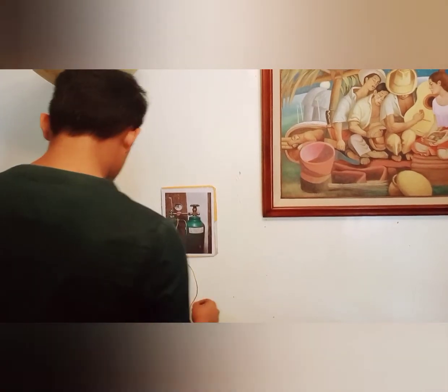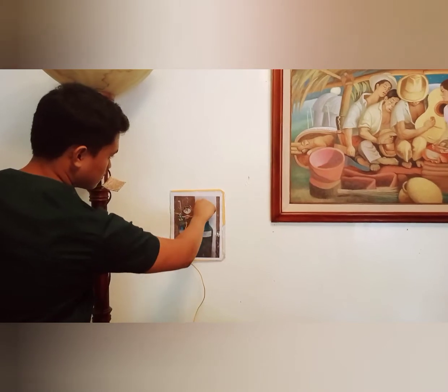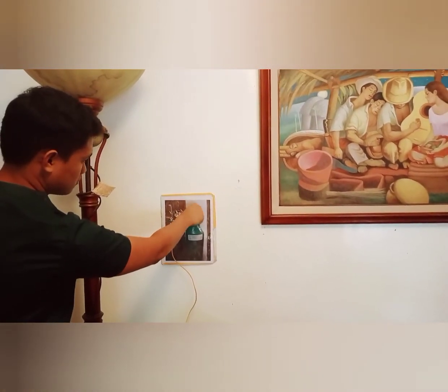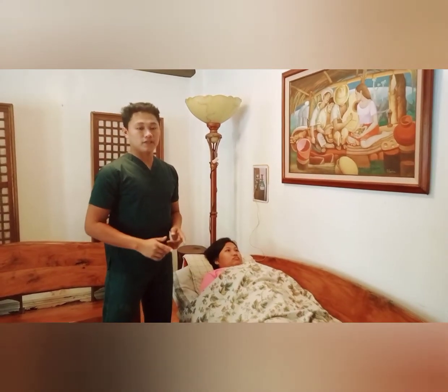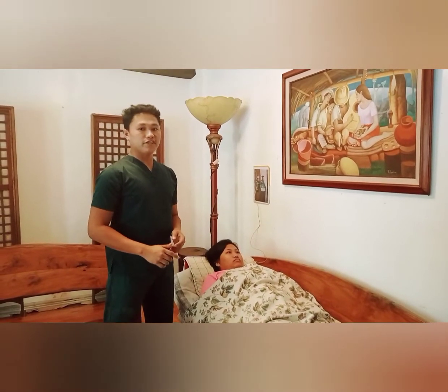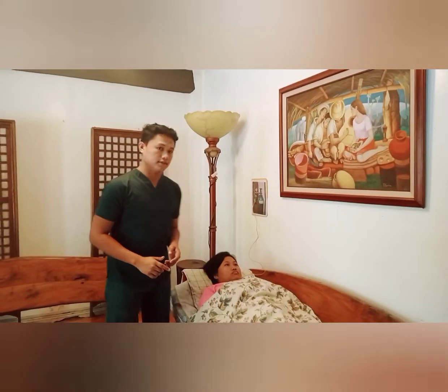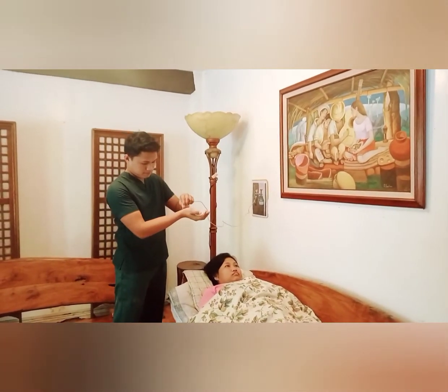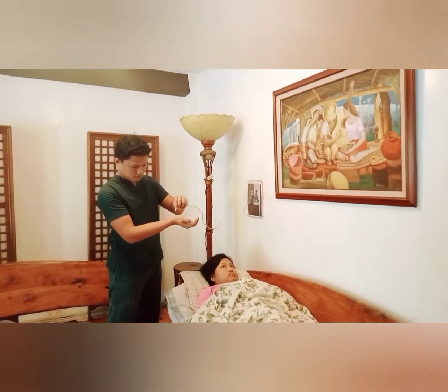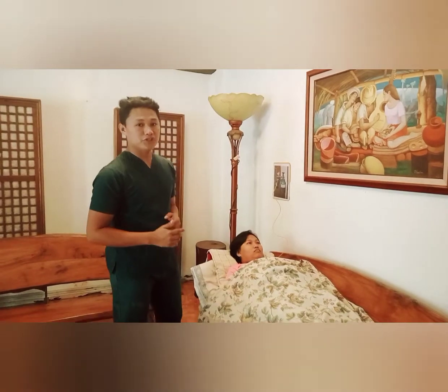So, I will turn on the oxygen tank like this. We turn the oxygen tank at the prescribed rate. Next, I will test the flow by setting the flow meter to 3 liters and checking the flow on my hand, like this. The rationale behind this is to provide the prescribed oxygen to the client or patient.